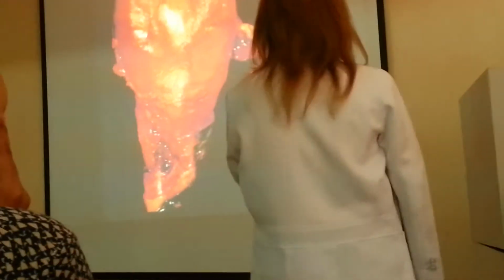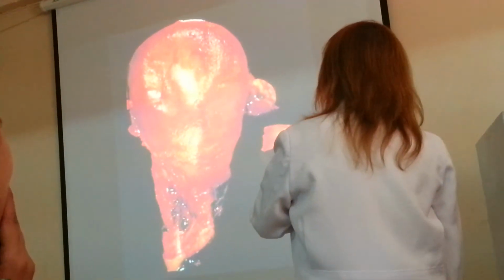So this is a picture of a normal uterus.